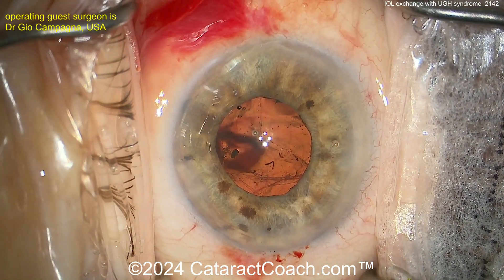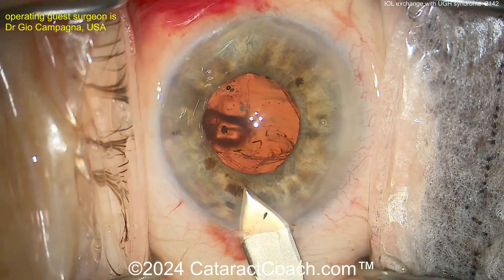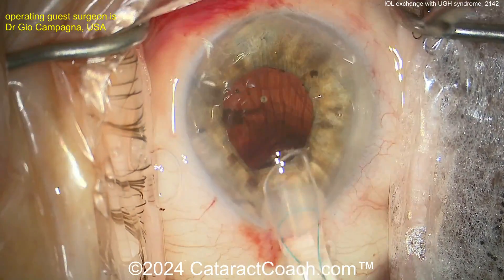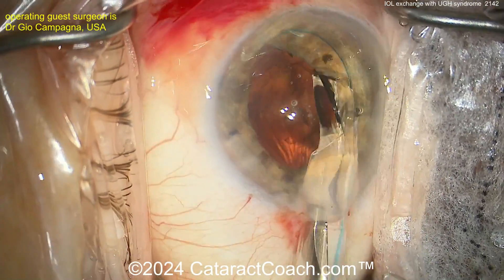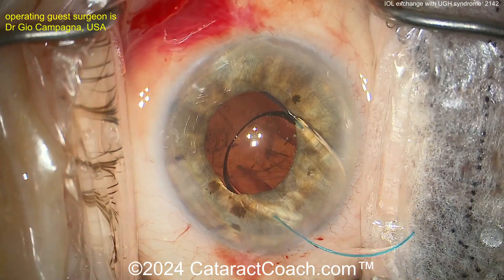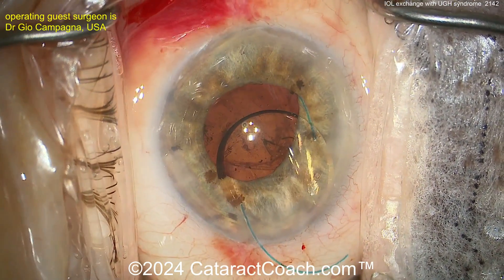Let's see what the lens choice is going to be — I'm thinking a three-piece lens. Enlarging the incision a little bit — why suffer? Here comes the lens. There's the three-piece lens. Leading haptic goes in — 7L rule: leading haptic like a number 7. Just put it on top of the iris if you want to, then dial it in. Make sure it goes appropriately into the sulcus. There are the thin arms — in the sulcus.